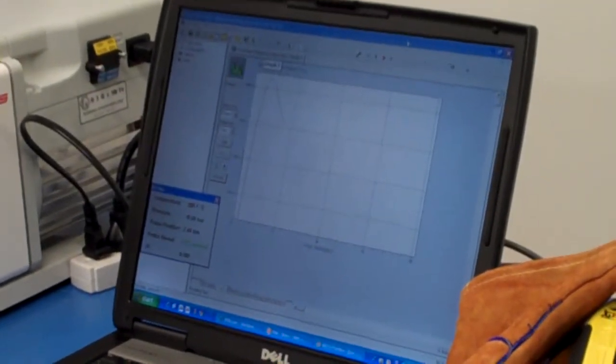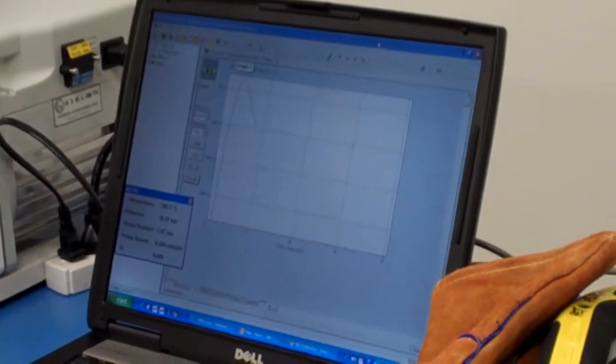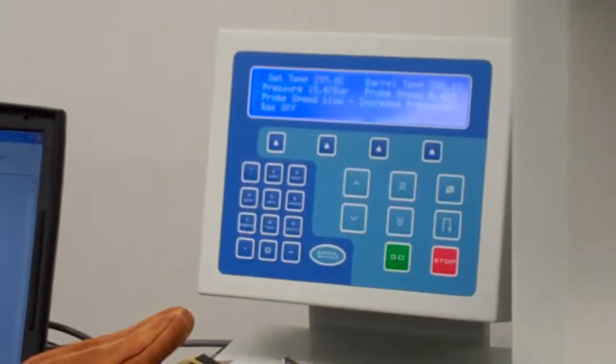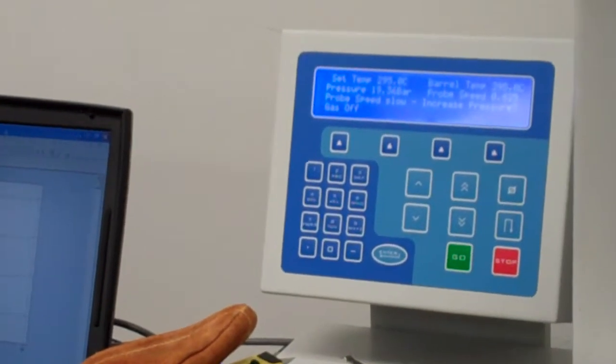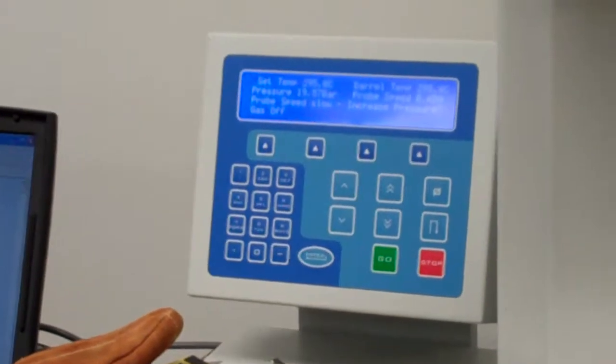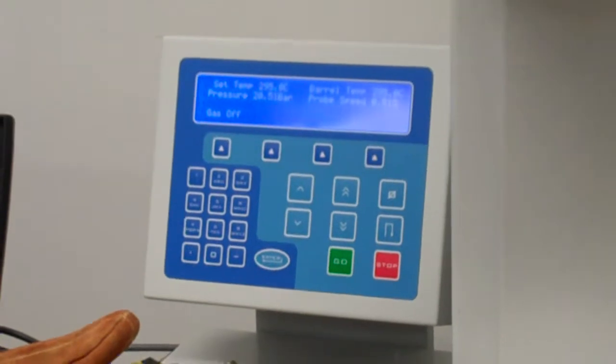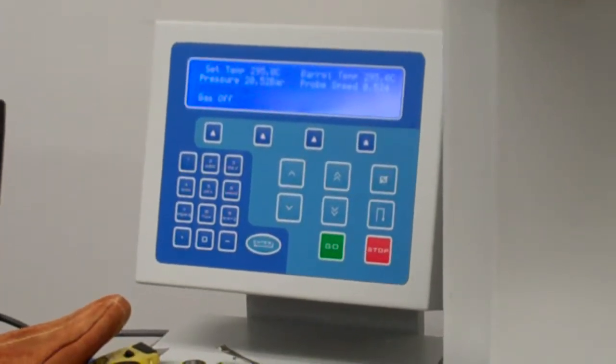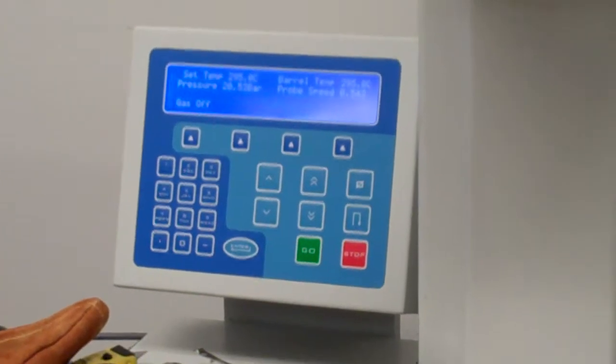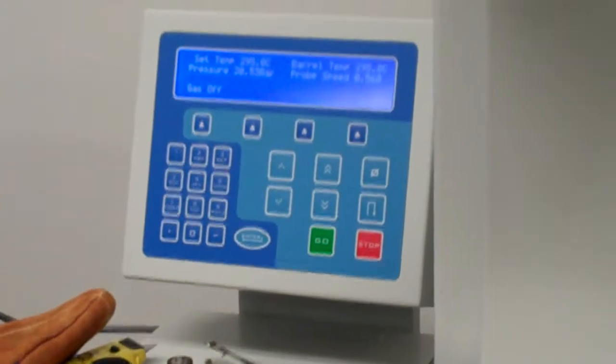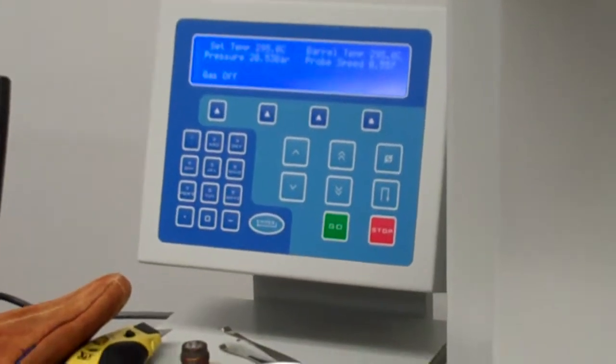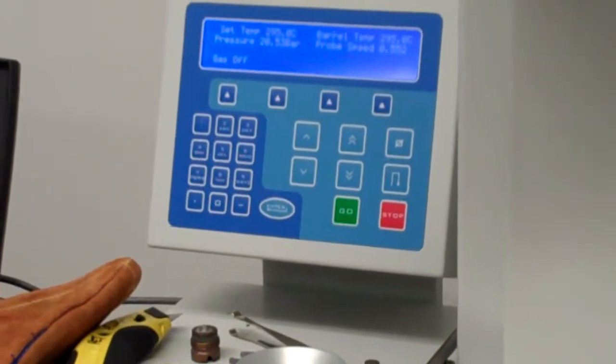Now at this point it could be just a hair fat. It's dropping again. See it? 15 should be too low. Yeah, that's fine. I'm going to rack it right up to 20 bar. I would expect with 0.8 to need a good 20 bar. If I don't, then I know that it's low IV or it's not dry. So is there, on the first sample for any material like this, is there a little playing around with it, and then you kind of tweak it for the following samples after that? And what's the ideal probe speed again?